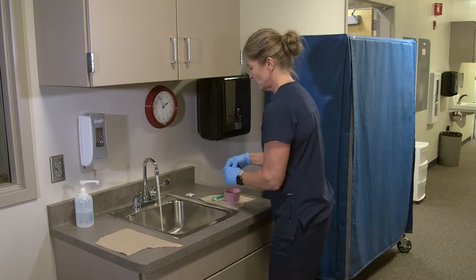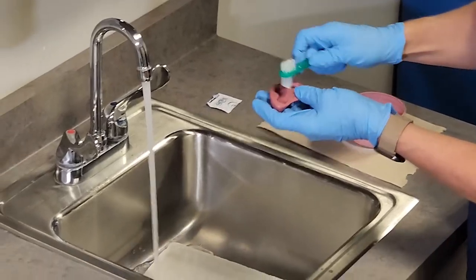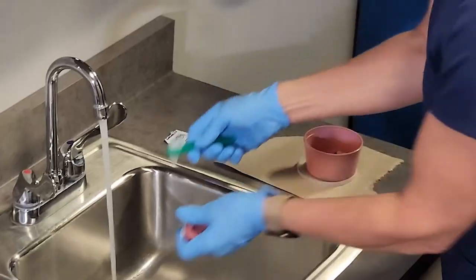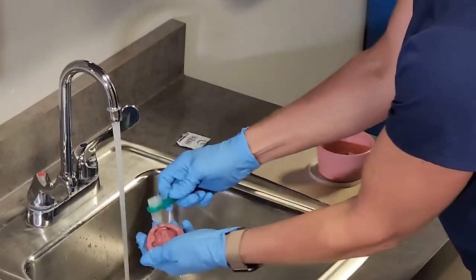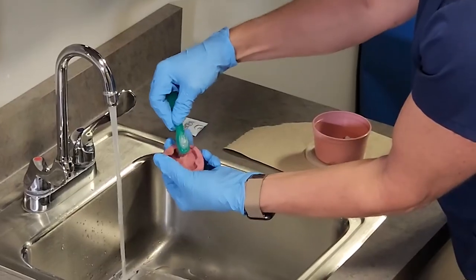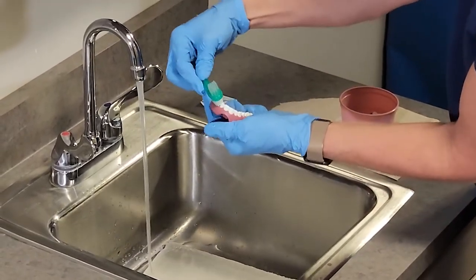I'm going to take the water. The denture brush has a long side and a short side. The long side goes in the grooves of the dentures and the short side is used for the teeth. I'm going to get both of those under the water and use the long part in the grooves of the dentures and then the short side on the teeth.